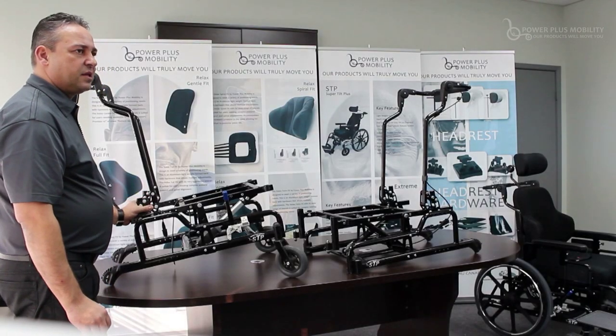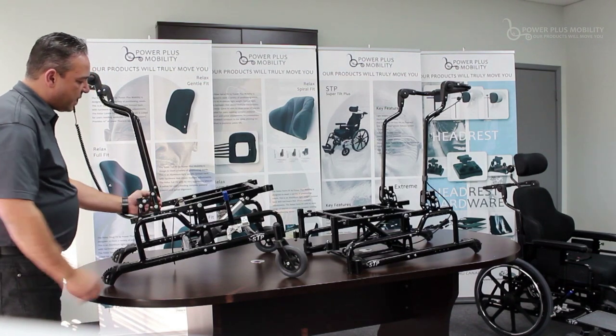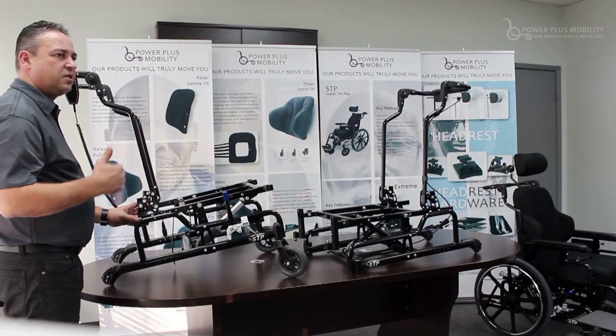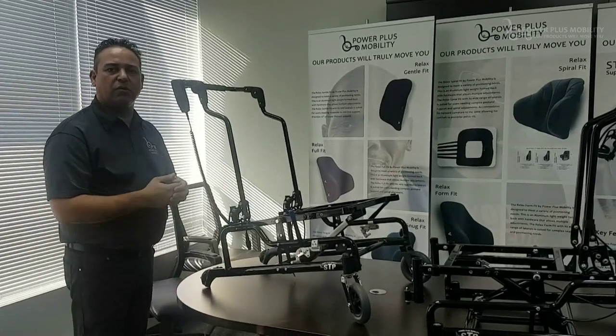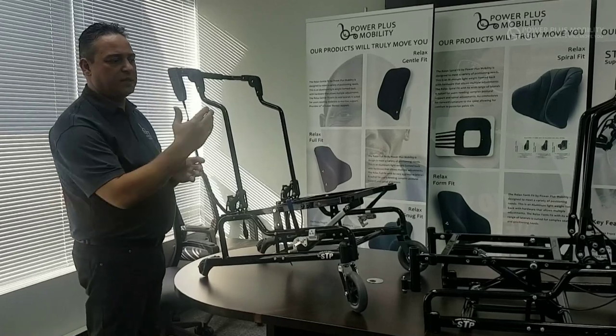We also have depth adjustability through the back canes, by taking the back canes and sliding them along the top frame by four inches — growing it from 16 to 20 inches or from 20 to 16 inches. So essentially there is four inches of depth adjustability for your center of gravity growth, and that applies to both frames.